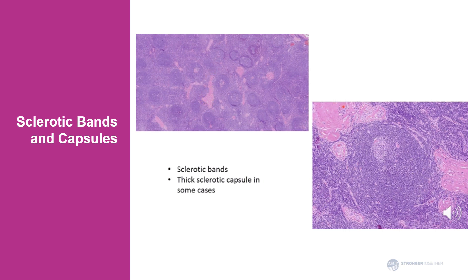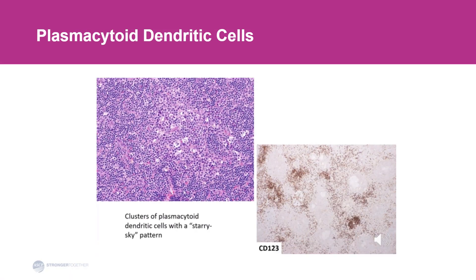This is a higher power of a sclerotic band. In some cases, we'll also have a thick capsule. An interesting and peculiar histologic finding seen in Castleman disease is clusters of plasmacytoid dendritic cells which have a starry sky appearance because they have interspersed paler cells, giving it a starry sky appearance. If you want to demonstrate plasmacytoid dendritic cells, you can stain with CD123, and you can see they are not only found in clusters but also interspersed in the interfollicular area and are definitely increased.